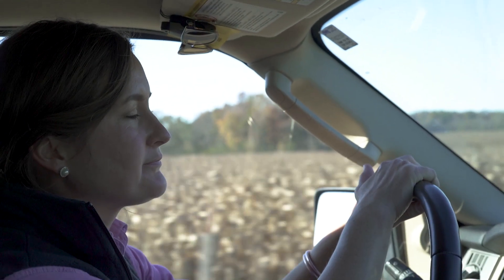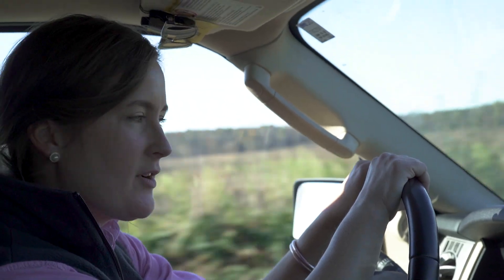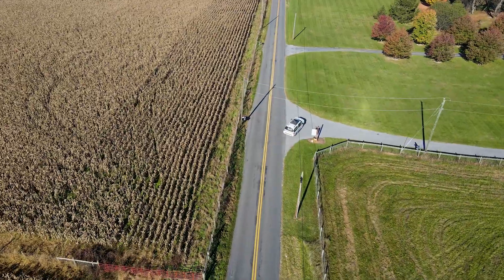Hello, this is Dr. Crawford. Hi, I'm here scanning Ellie with the ultrasound. I'm looking at her neck and I think her articular facets don't look totally normal. I would love to get your opinion if you wouldn't mind logging into the Exipad. Alright, let me go ahead and pull over and I'll log into the Exipad and take a look.